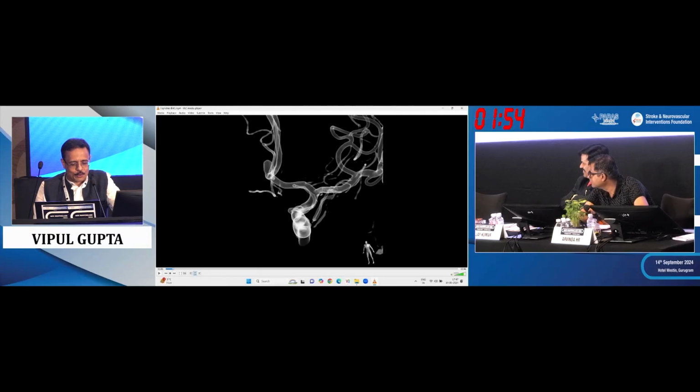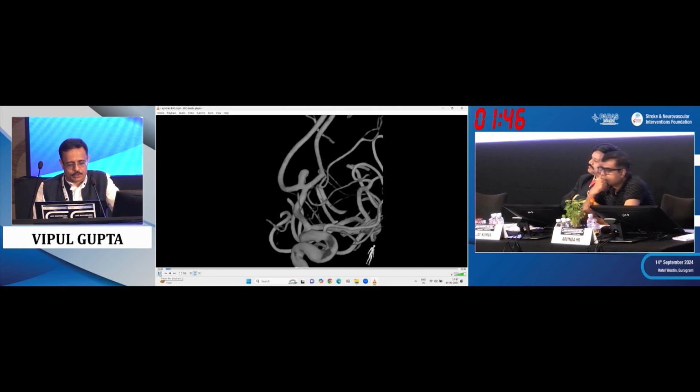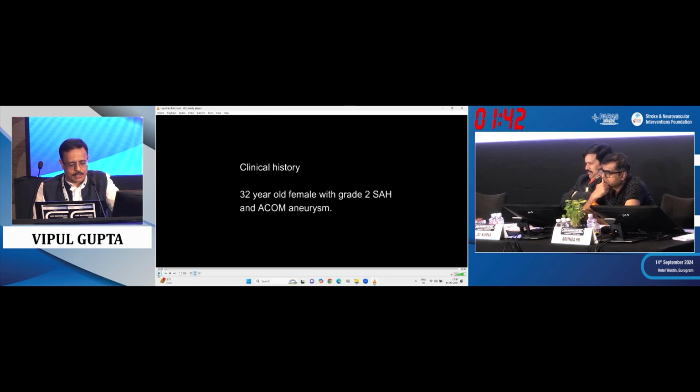All right, let's come to another small ruptured aneurysm. I mean, we want to discuss them because all of us see them a lot. These are major practice. So something like this, how would you treat? You can again go back.